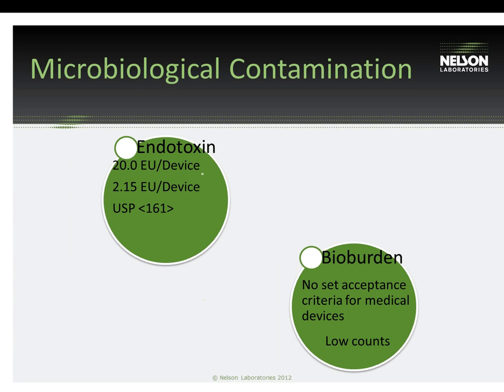However, low bioburden counts, maybe low counts of aerobic bacteria and fungi, for example, can again help justify that you have a clean device. And you can see with cytotoxicity, endotoxin, and bioburden, these are just tools to give you more data to show in your overall cleaning validation that you have a clean device.